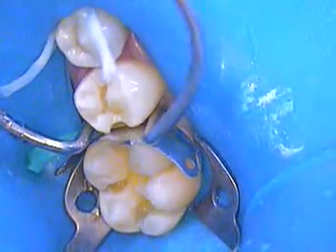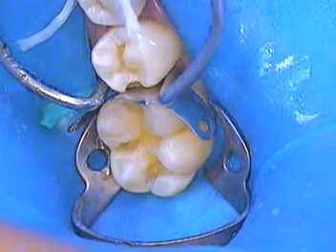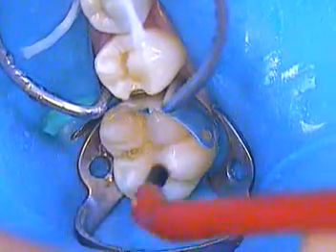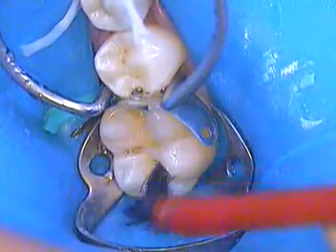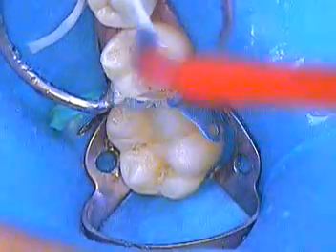Now we can go ahead and apply tubulacid. That's our chelation technique — 15 seconds on with that, then we'll suction that off and go right into adding our adhesive.